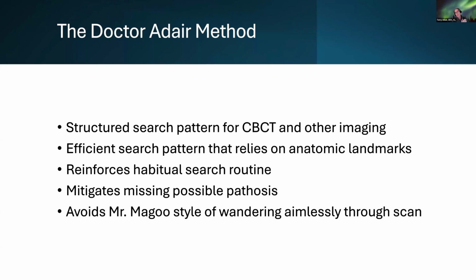Plus, it avoids the Mr. Magoo aimlessly wandering through a scan. It locks you in on a repeatable pattern that hopefully you habituate yourself to repeat all the time.